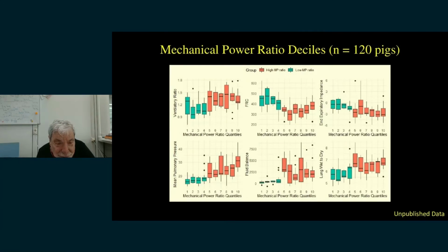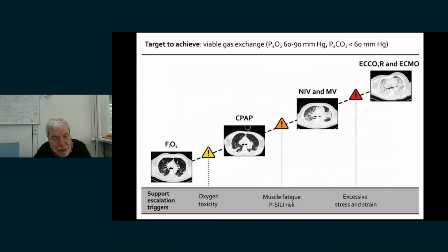You have a sort of threshold. That means total ventilation expressed also as a possible threshold is not perfect, but it is a way to look at it and to organize mentally, saying, okay, it's 3-4 times what I expect. I have a tremendous problem.